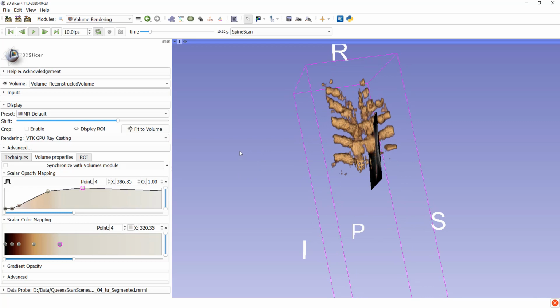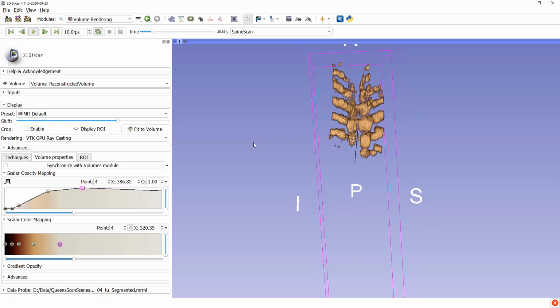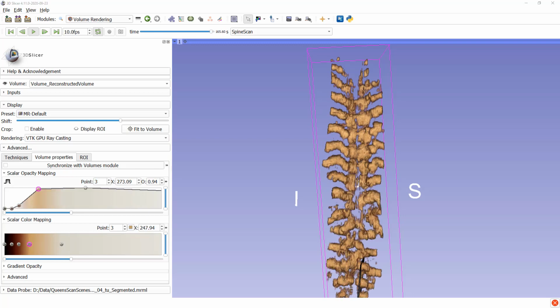Of course, ultrasound is not as detailed as a CT volume would be of the spine, so we need some anatomical knowledge to mentally reconstruct the full spine from these images. This is only the posterior surface that is accessible for ultrasound, but we can see the lamina parts of the vertebrae in the middle and the ribs attach to the vertebrae from the sides. Here I've sped up the video so we finish the entire spine scan so we can see the final result.